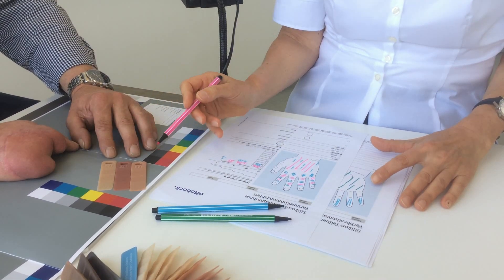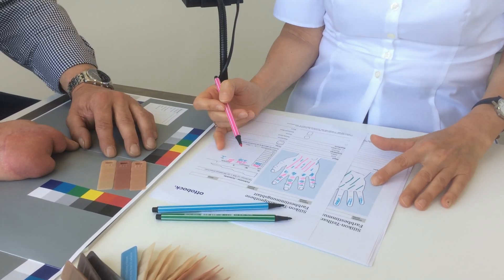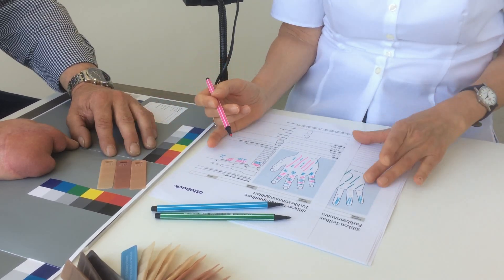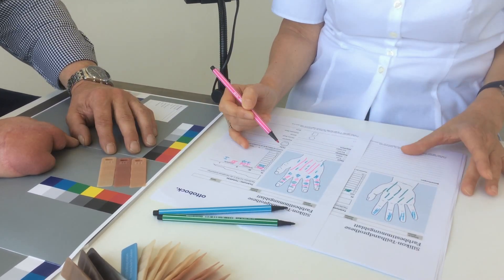Finally, I enter the skin tones I've identified on the respective color determination sheet, using colored pencils to sketch the base, character and palm colors. I also enter the color number and intensity on the color determination sheet.